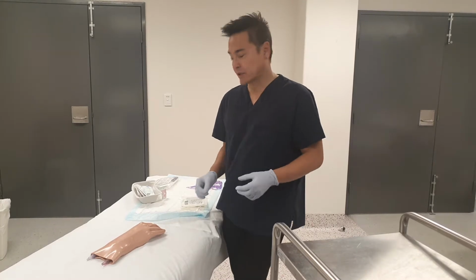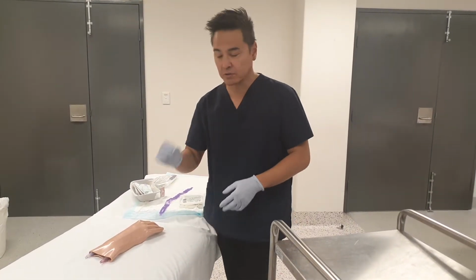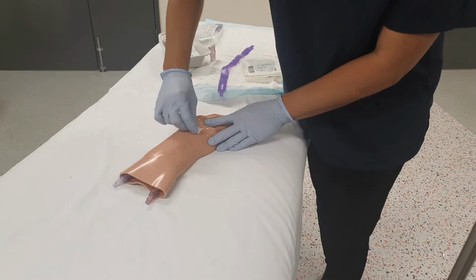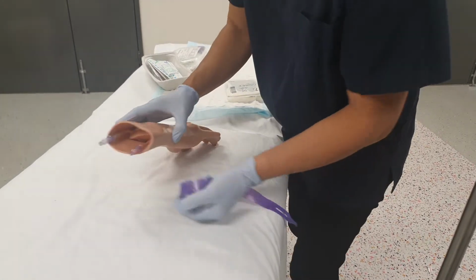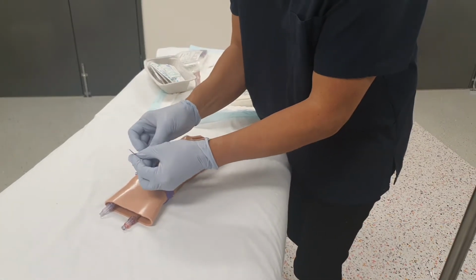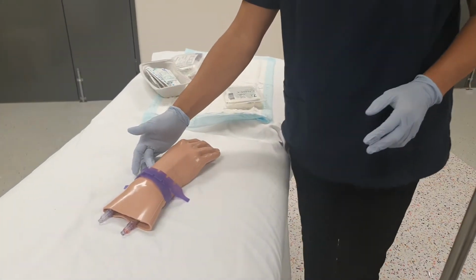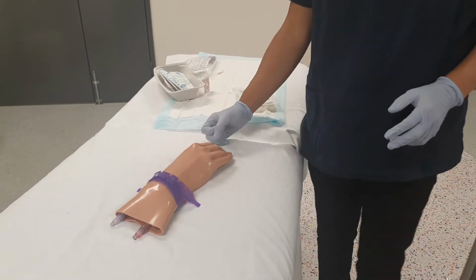I like to put a tourniquet on and actually have a look at the patient's arm after we've established a bit of a rapport, and I do like to take an alcohol wipe with me and just give the place a clean. I don't think that you can be too clean when it comes to these procedures. All right, I don't mind putting on an IV tourniquet and leaving it there. It's okay to leave a tourniquet on for a while, as long as you can palpate the radial artery, and you can also do some circulation observations that are acceptable.